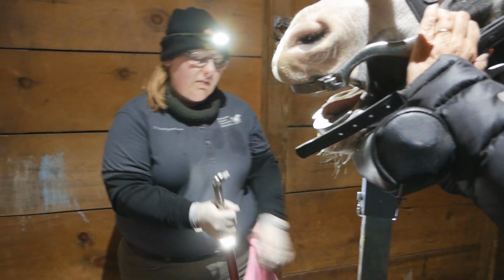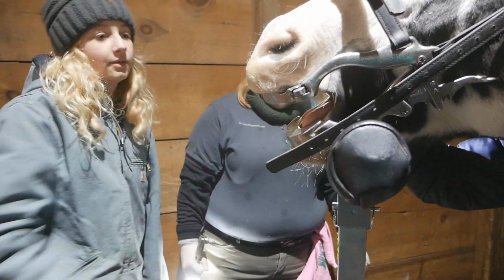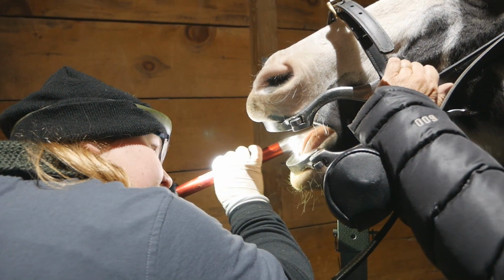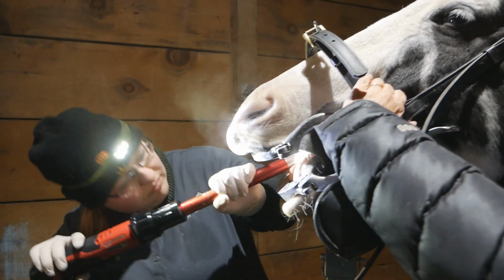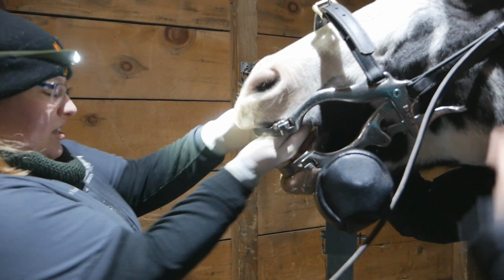All right, take a feel, see what you think. Same place. Yeah, a lot smoother, and that should feel a lot more comfortable rubbing up against his cheeks. So we're halfway there, we got some on the bottom. All right, let me take a look and feel, see what we've got.